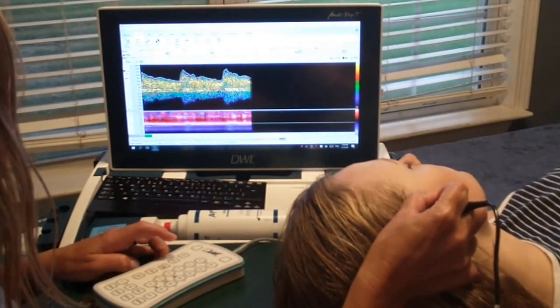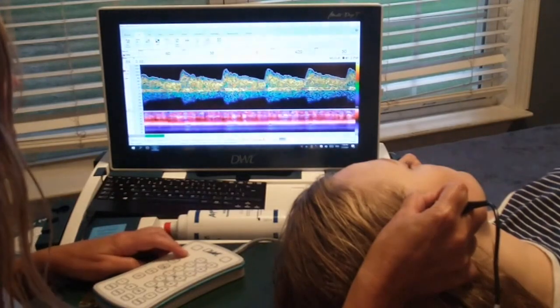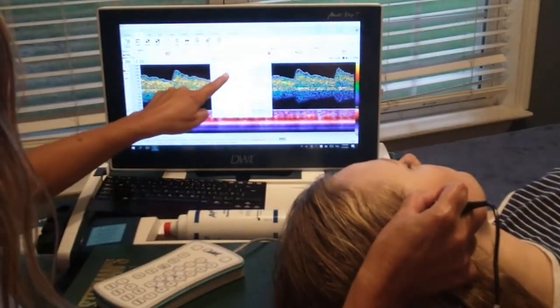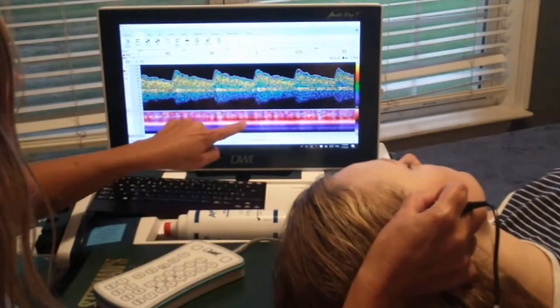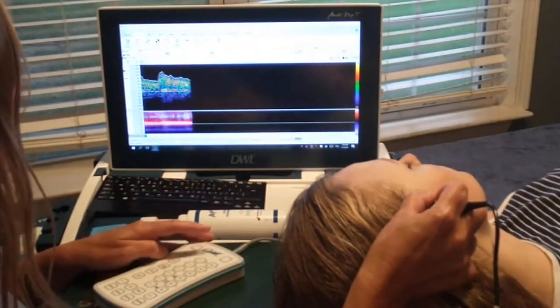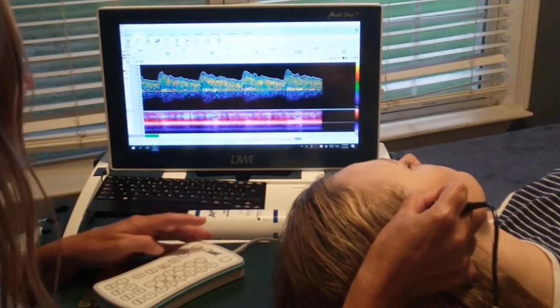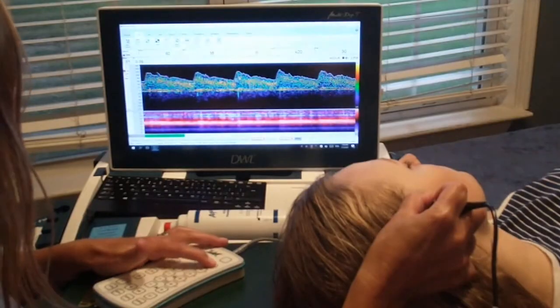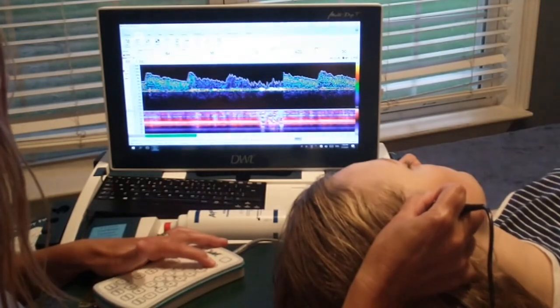And from here, we're going to get the distal ICA. To change our label, we'll hit the hand freeze button on the remote, select distal ICA. We're going to want to increase our depth, preferably at least by 4 millimeters. So you'll hit button 2 times.